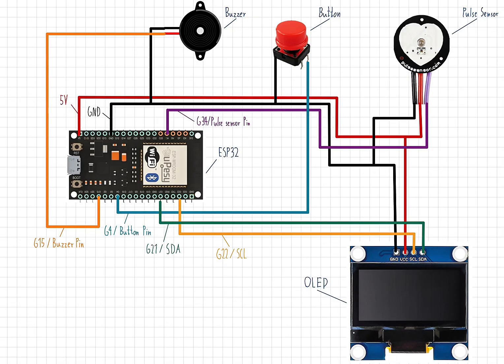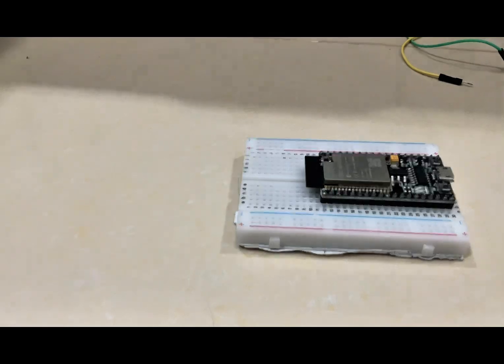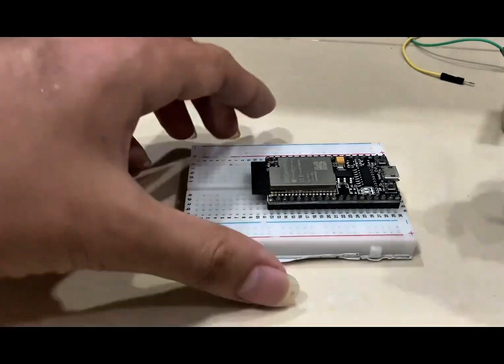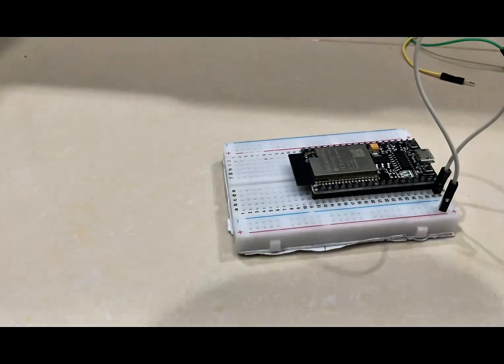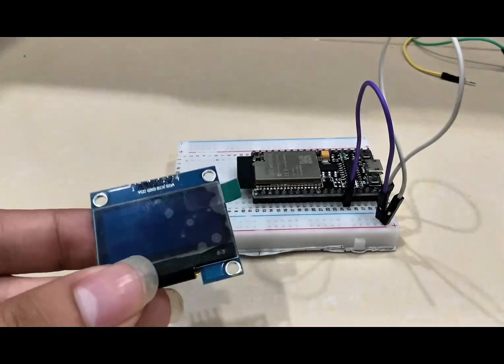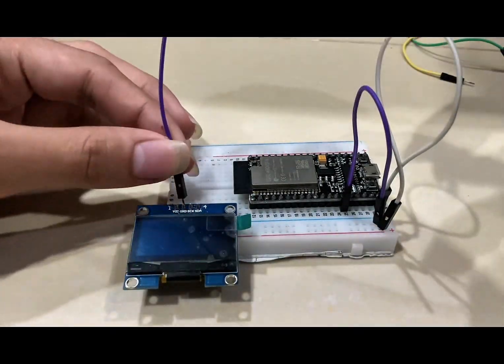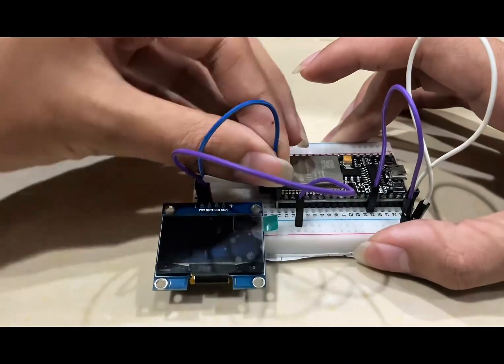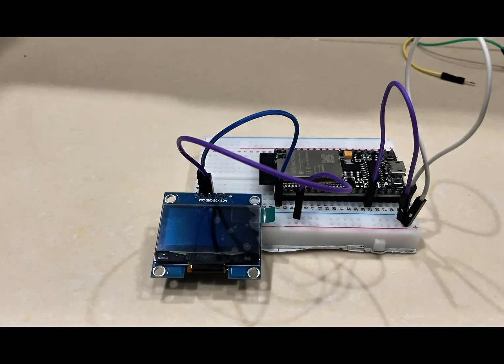Next, we do the wiring. So this is all the components and wiring that I use. First, we will connect 5V and ground for all devices. Next, we will connect the OLED, so the ground goes to the ground. But for VCC, we will use the 3.3V for the OLED.